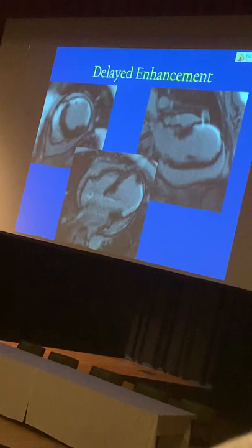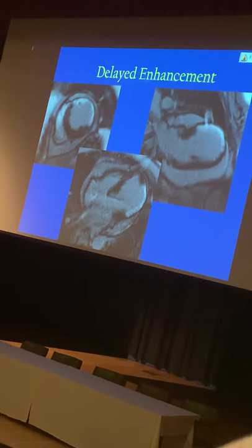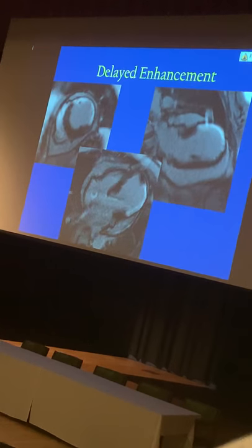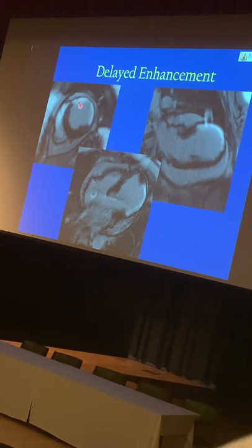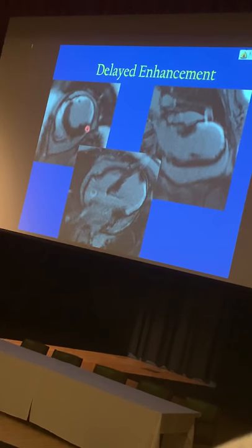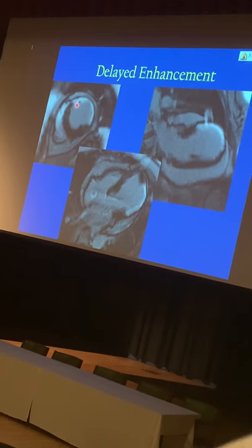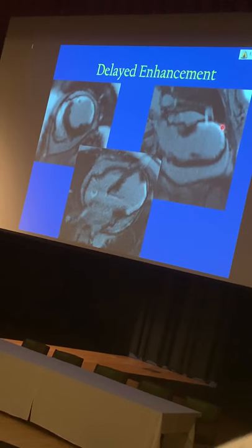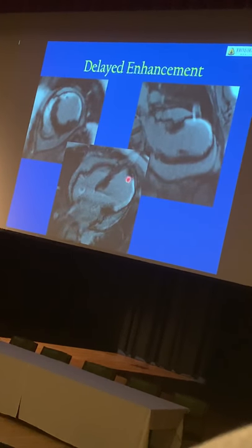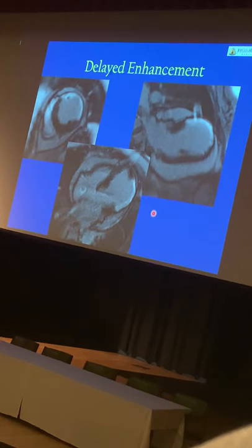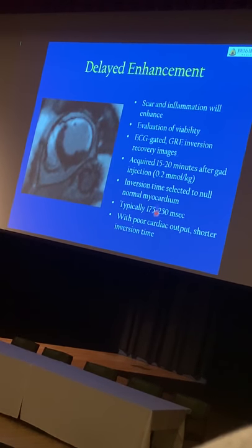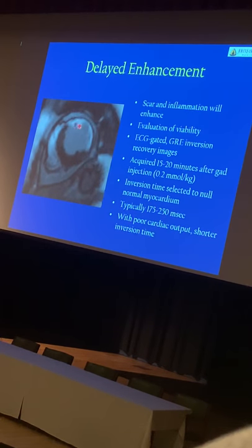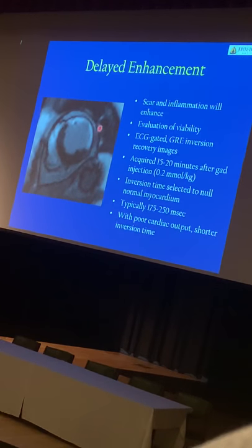Another key sequence in any cardiac MRI is the delayed enhancement, or late gadolinium enhancement. In this example, you can see that the normal myocardium is black, but the myocardium in the anterior and lateral wall is thinned out and abnormally bright. You can confirm this finding on the VLA and also on the four-chamber view. This is due to a previous myocardial infarction in the LAD and circumflex territory, resulting in thinning and scar development of the myocardium.